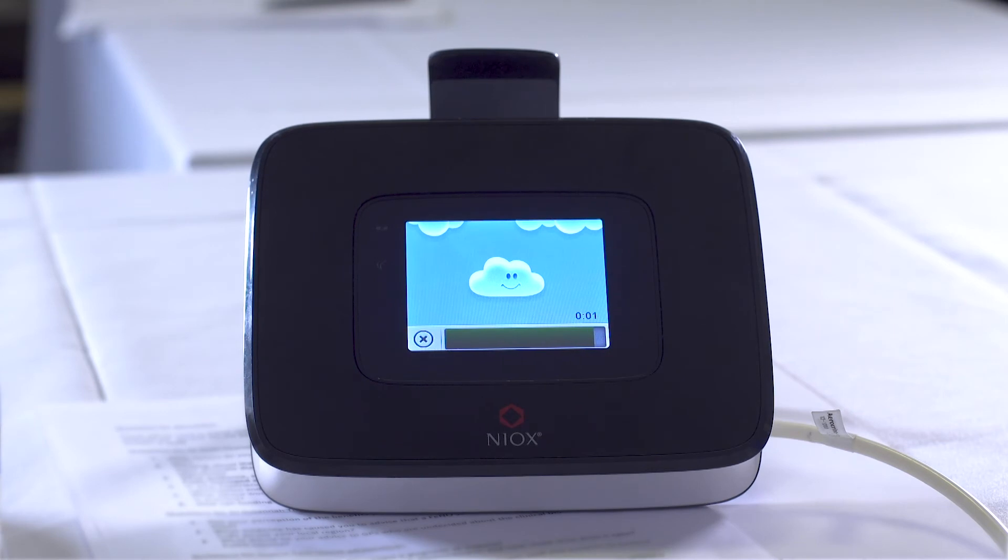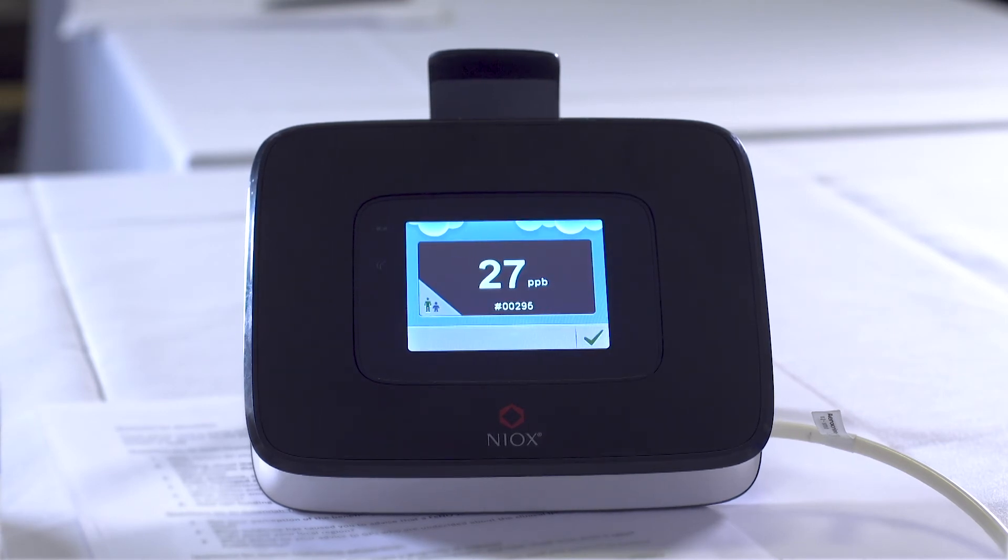Is this something you'd need to repeat? Let's have a look and wait for the number. So that is 27 — that puts you in the intermediate category where you may well respond to inhaled corticosteroids. Based on your history it would be a good idea to get you on a trial of inhaled corticosteroids, and in answer to your question about repeating the test, I'd like to have you back in four to six weeks to find out whether your symptoms have improved and repeat this test. I'll be hoping it's gone back to a normal level, which would be below 25.